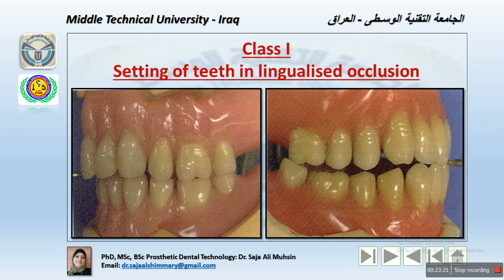This tooth is not in occlusion at all because the occlusal table finally ends with the molars, and you can notice that the tooth relation is a tooth to tooth relationship. This tooth is not in occlusion during normal mastication excursion, but will occlude with the upper molar during protrusive excursion and when incising through food. This negates the effect of Christensen's phenomenon, a disocclusion of the posterior teeth in protrusive excursion, which occurs in natural teeth, and provides balanced occlusion in this excursion.